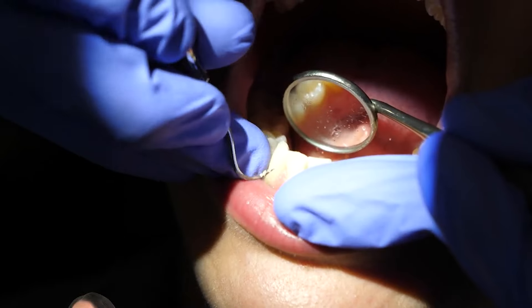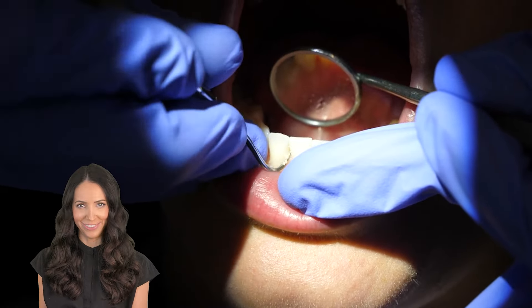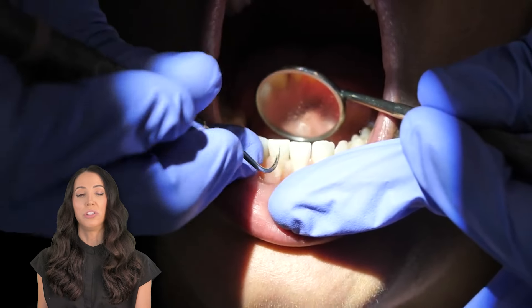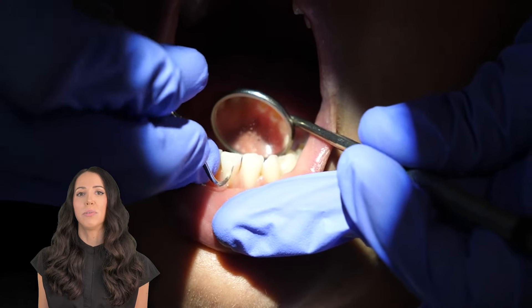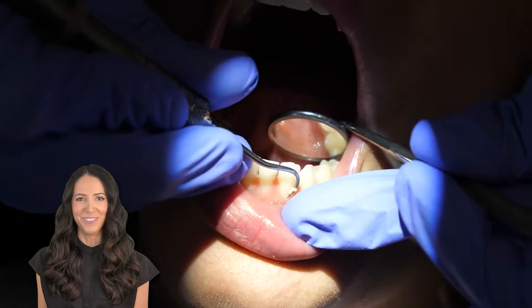Now let's watch the example. Tell yourself one surface at a time — right now I'm cleaning all of the surfaces away from me. If you're not a dental hygienist but you're watching because you like teeth, I hope this is soothing — a little bit of ASMR, music to your ears. Here you can see I'm still cleaning the surfaces away from me, but I am now on the facial side. I do sometimes wrap around the direct facial — you'll see me doing it in just a second.